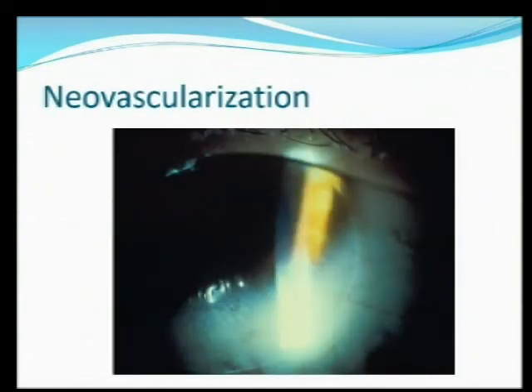And here's a soft lens wearer. And you can see how far the vessels invaded. Clearly somebody that didn't come back for follow-up visits. It's a shame, because they should never ever wear a contact lens again.